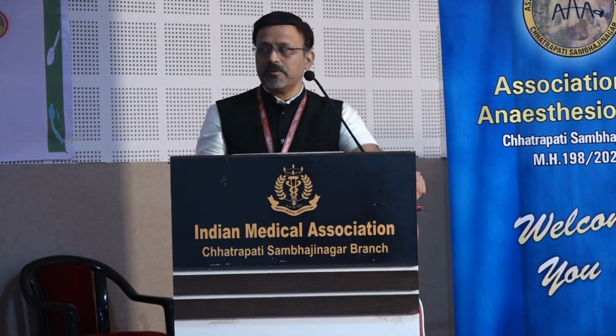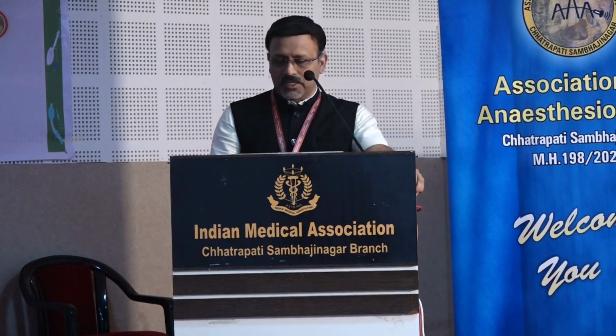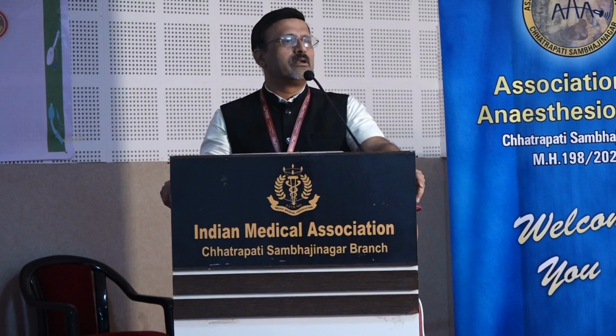There are different guidelines. Previous guidelines were from the Difficult Airway Society. These are guidelines by the Indian Society of Difficult Airways. There are some changes. In these guidelines, they say that you continuously give oxygen at 15 liters throughout when you are intubating. These are the finer points, but overall, the general message is the same. Now, we are going to demonstrate this on the table. If at all there is a very difficult intubation, but you are able to put in a laryngeal mask airway, how to intubate through the laryngeal mask.